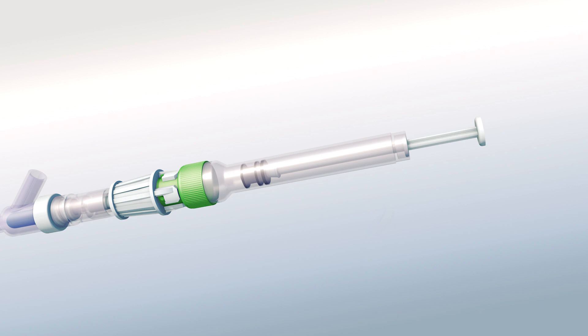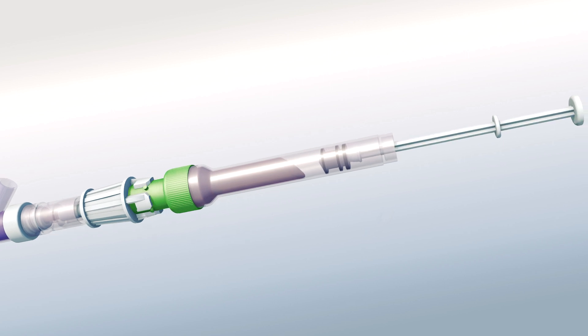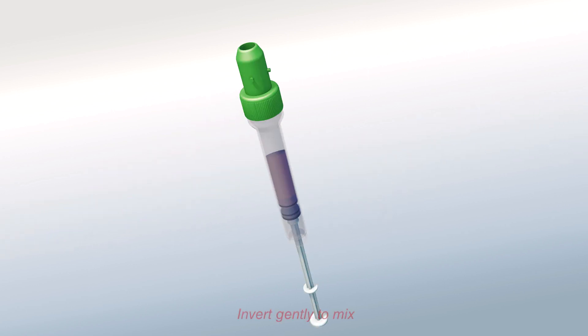Using the tube like a lure syringe, pull the plunger back on the Monovet to collect a minimum volume of blood. Disconnect the Monovet by the cap with two fingers, turning it slightly to the left. Invert gently to mix.